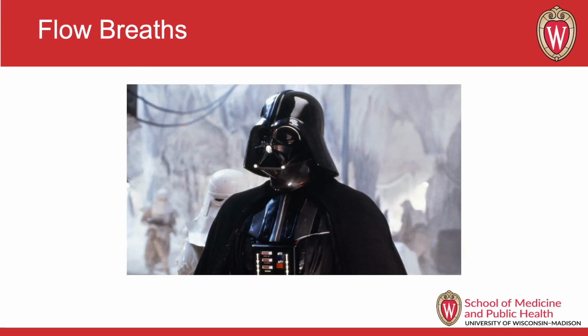That's the half a breath. That's it. The other type of breath is called a flow breath, and I always have nicknamed these Darth Vader breathing. Let me show you why.